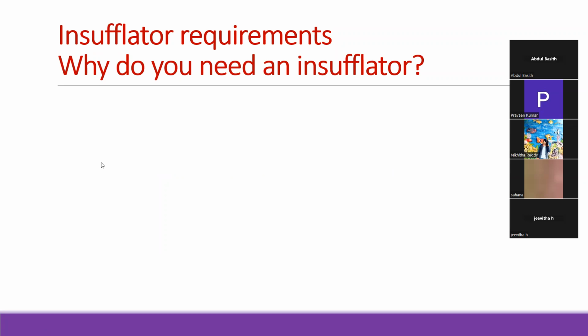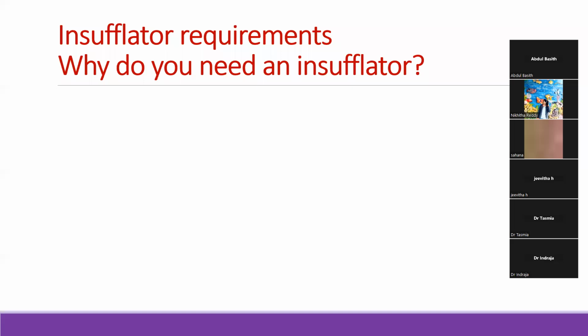Okay, and we also mentioned how people can pump air into the abdomen, and we said why we shouldn't use air and put carbon dioxide in. But why do you need an insufflator? Praveen. Sir, to identify the pressure and flow rate of the gas we are pumping.